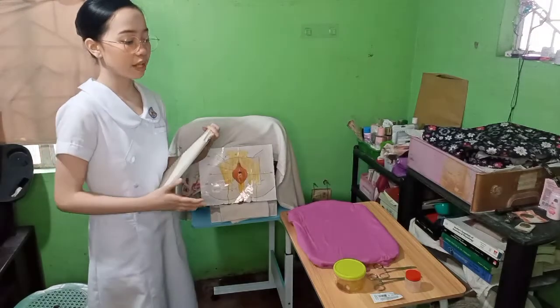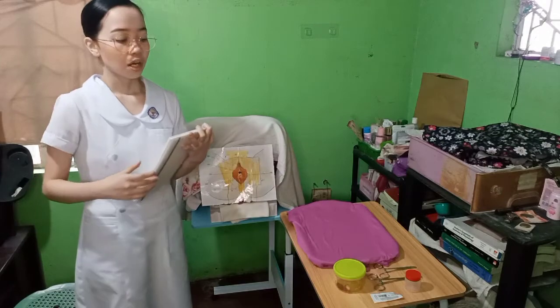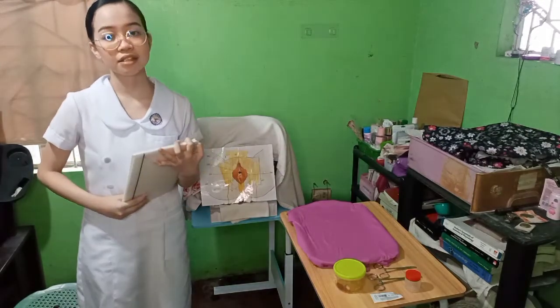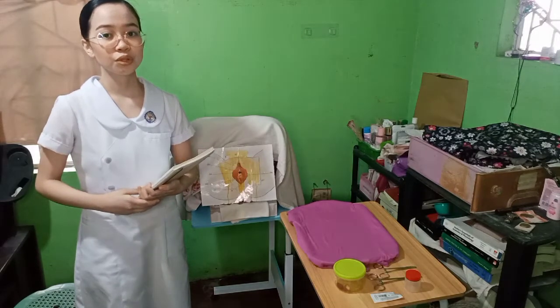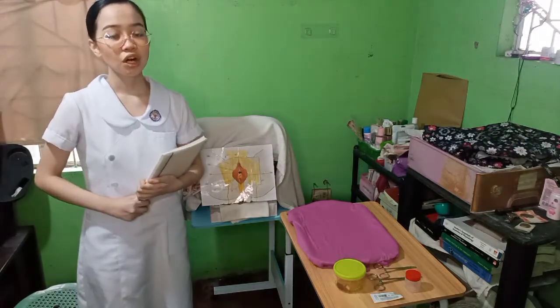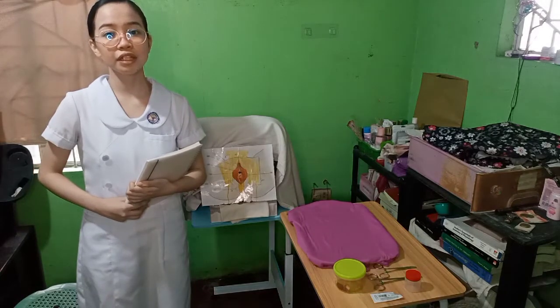So we have obtained a pale yellow to dark amber color of urine, and also it is transparent, and that is also normal. And then also check and record whether the specimen was sent to the laboratory for examination or urinalysis. Remember to record all the procedures that we have done, including the steps and rationale, because everything that is not properly documented is considered as not done.